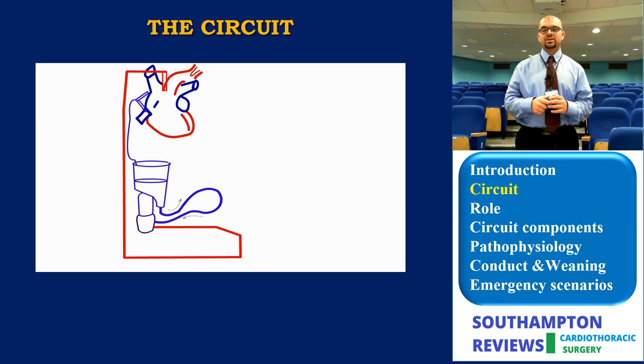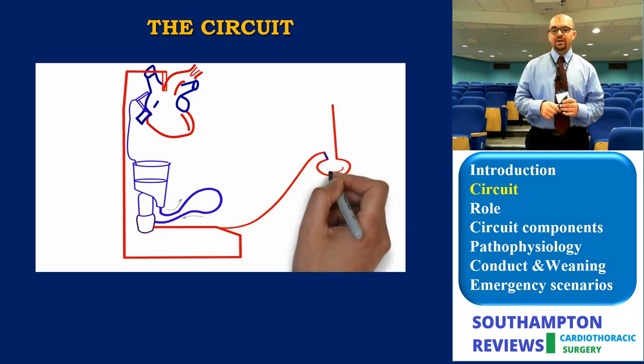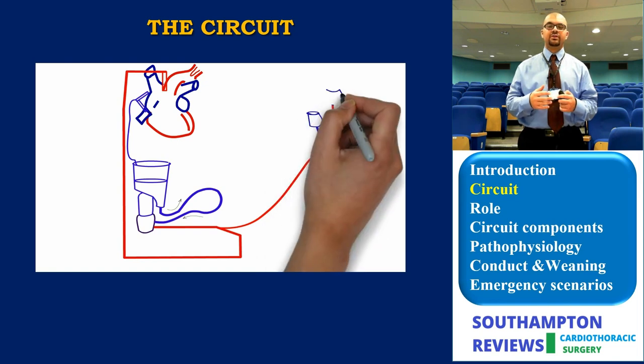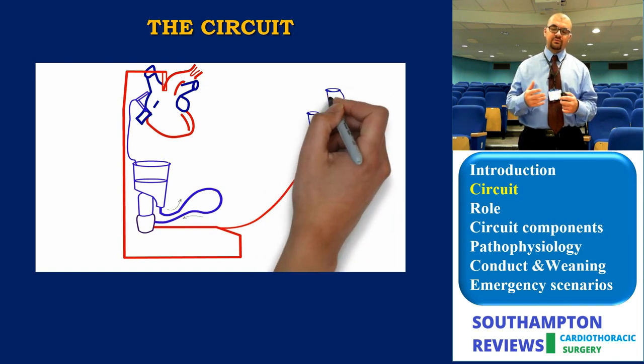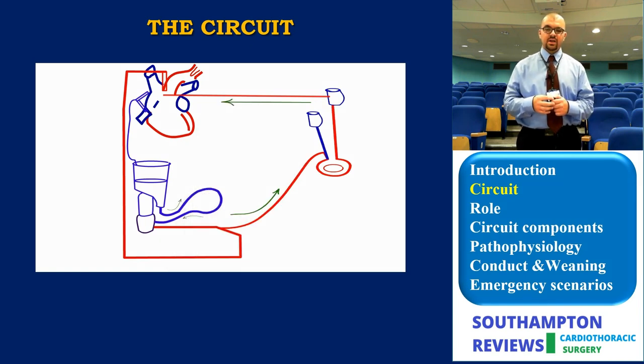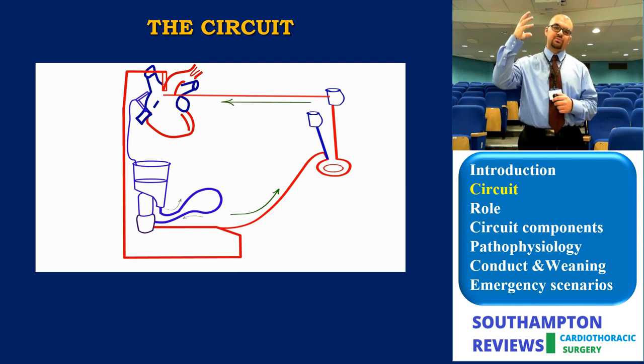The second part is the cardioplegia. This is one of the common fashions in a situation where we are giving blood cardioplegia. Of course, there are various ways of setting it up, but this is one of the very common ways. In a situation where you're giving blood cardioplegia, you lead blood from the oxygenator to the cardioplegia pump, and a cardioplegic solution provides the cardioplegia part of it in a 4-to-1 fashion.